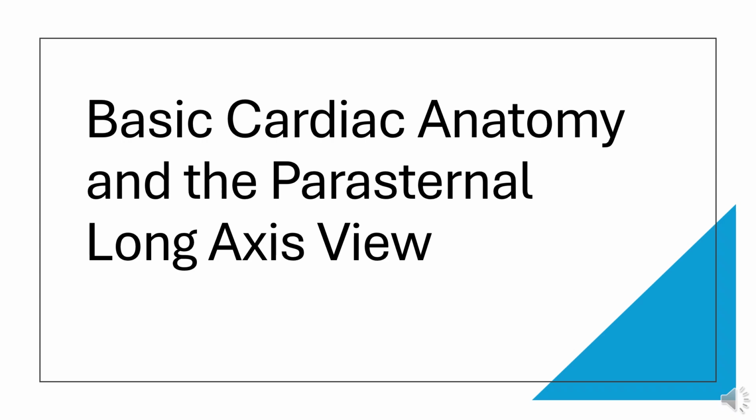This video is intended for students that have just been accepted into a cardiac sonography program. The question that I get asked the most from incoming students is, what can I do to prepare for the program? And I always say, know your anatomy, which everyone replies, I know my anatomy. But what I mean by know your anatomy is know your anatomy when looking at the heart on the ultrasound machine.